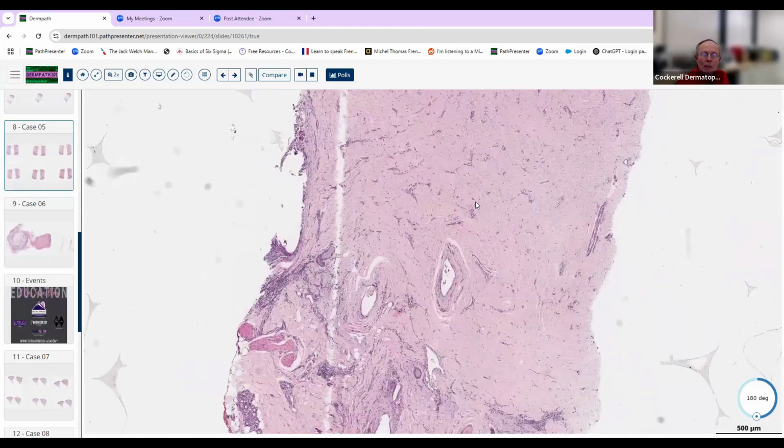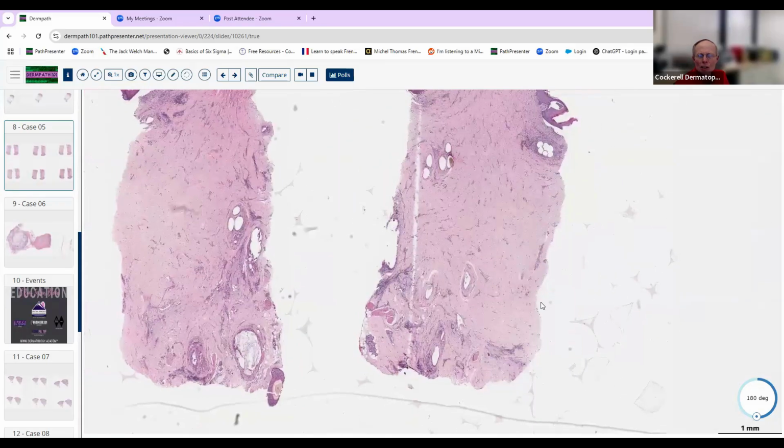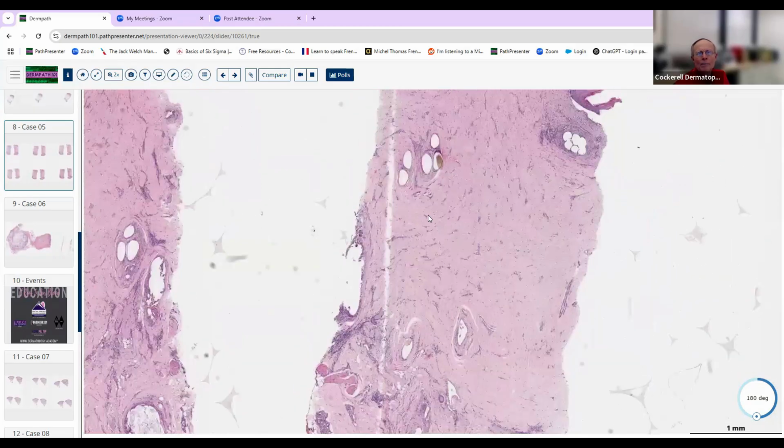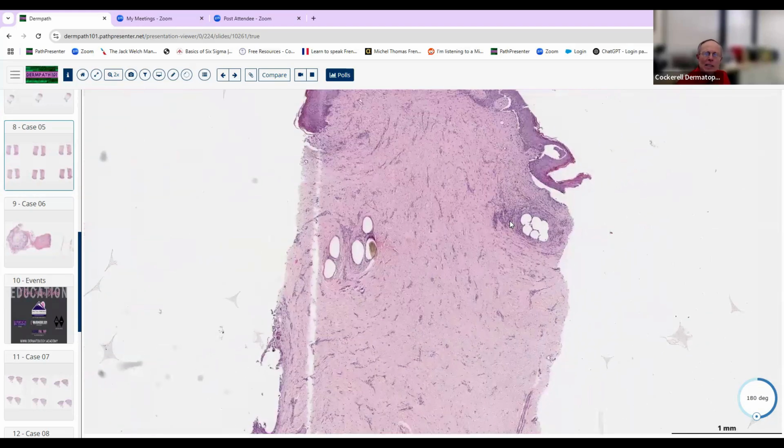But just realize that even though you get targeted inflammation of the follicles in lichen planopilaris and CCCA, when you get secondary rupture of those follicles and it gets more diffuse, then you can end up with diffuse scar like we see here. This onion skin fibrosis around the follicles like this, that's really very helpful, seen far more commonly in CCCA and lichen planopilaris and FFA than it is in something like, for example, folliculitis decalvans.